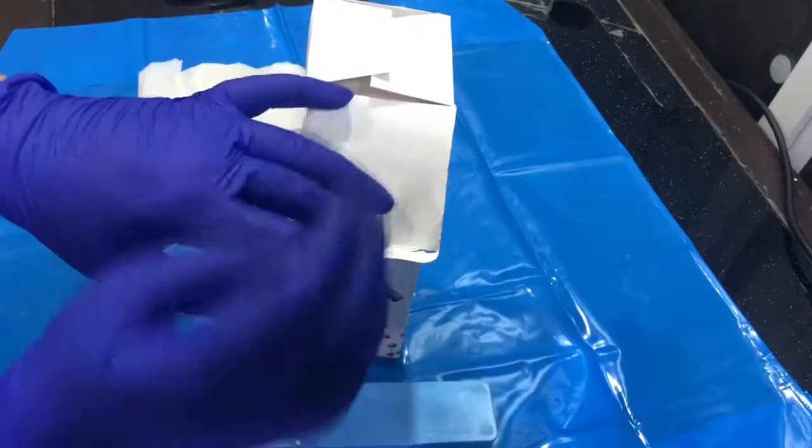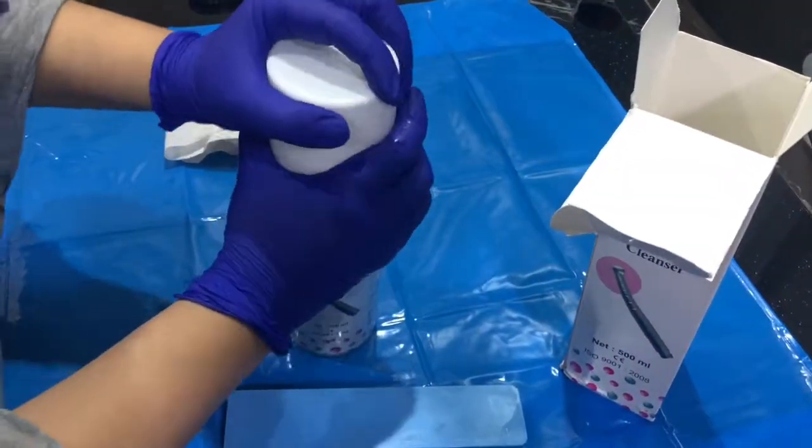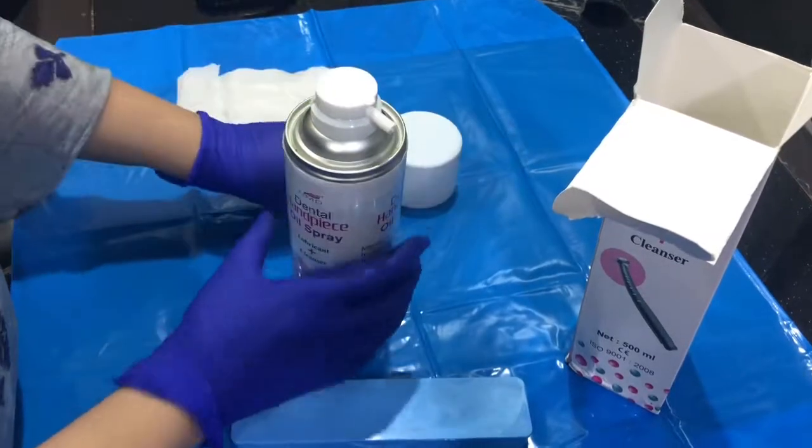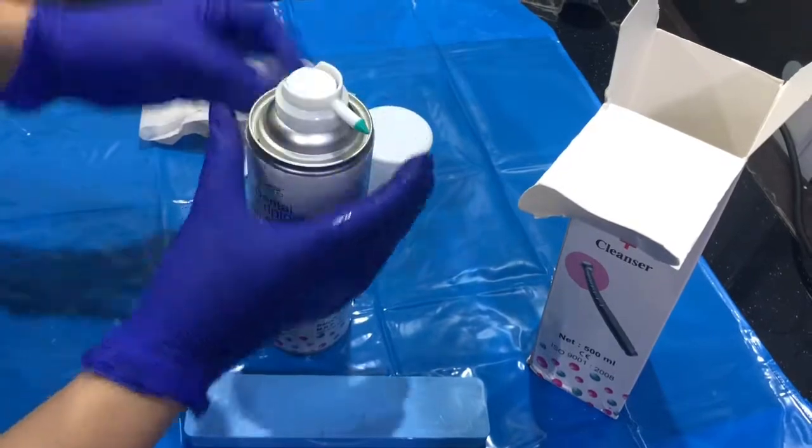Let me show you how it works. You have to remove this bottle first. There is a nozzle which you have to fit in here, and you have to remove this cap.